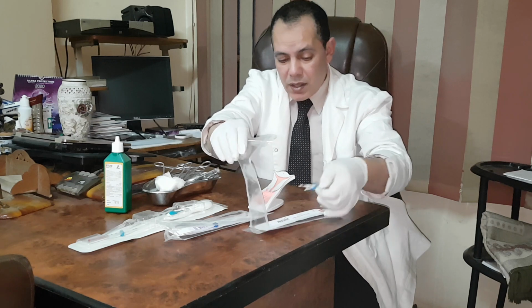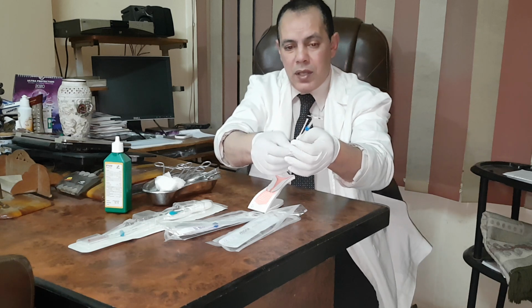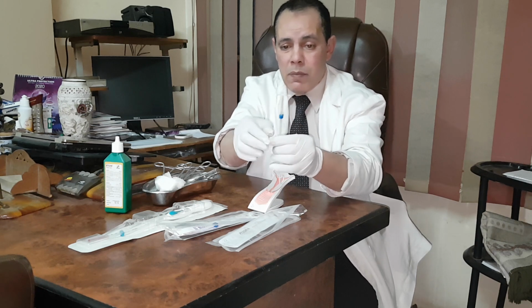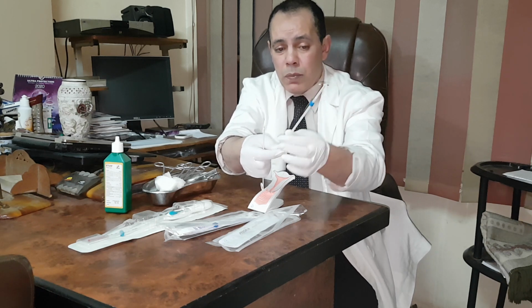This one is Copper T 380. Copper T, as you see, looks like a T figure, loaded with copper in the transverse arm and in the vertical arm. This is called the sheath or the insertion tube.